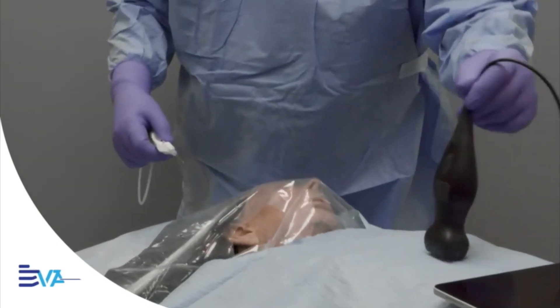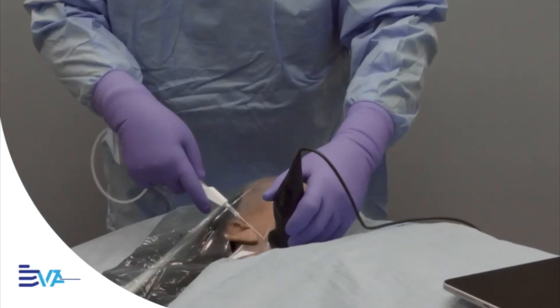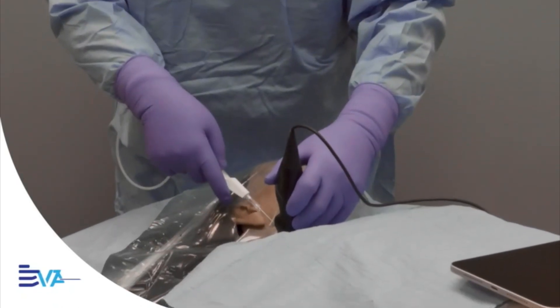We've taught medical students, nurses and even non-clinicians to do this — safely, accurately, in just minutes.